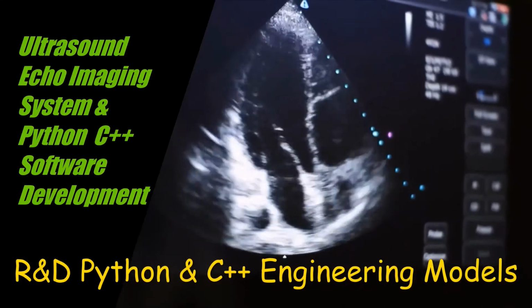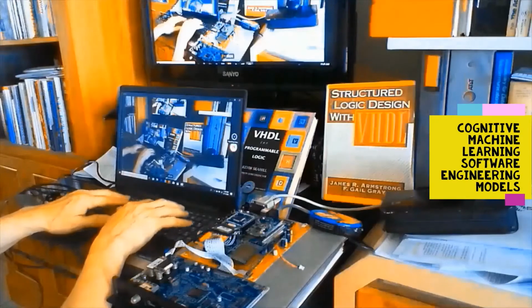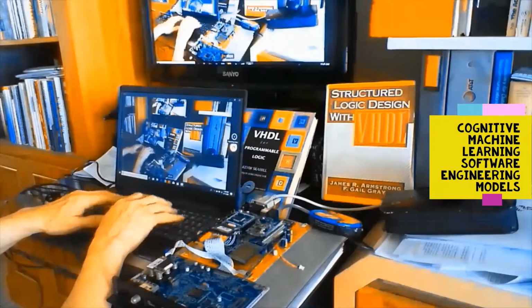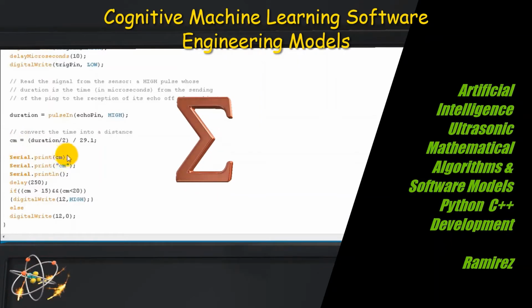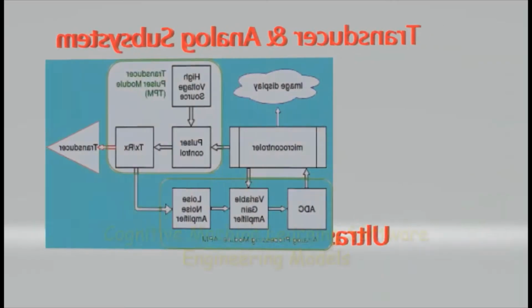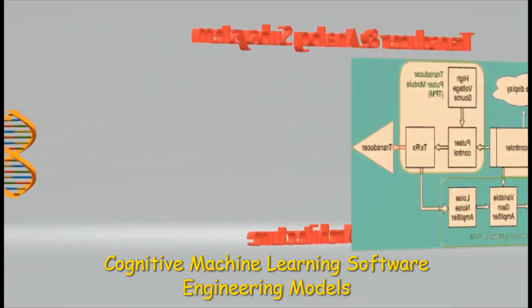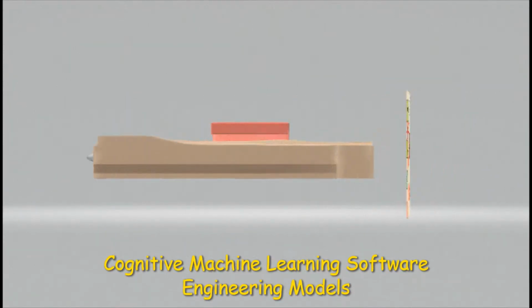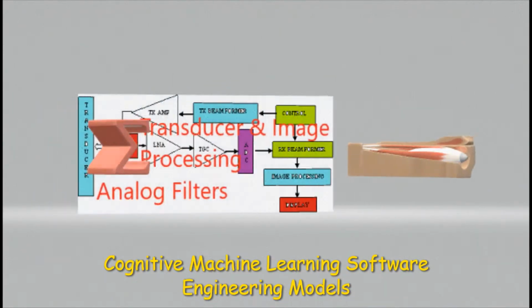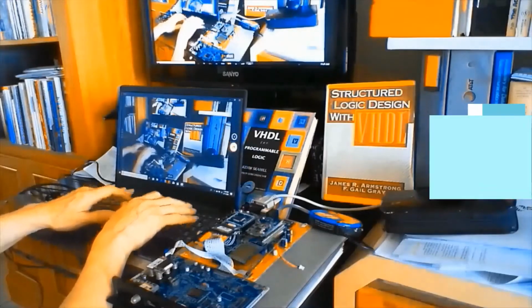We have used the open source 40 megabits per second data acquisition module in conjunction with the neuromorphic architecture and an IDE compatibility for the microcontroller using C++ language, Python, as well as Linux as the main operating system.